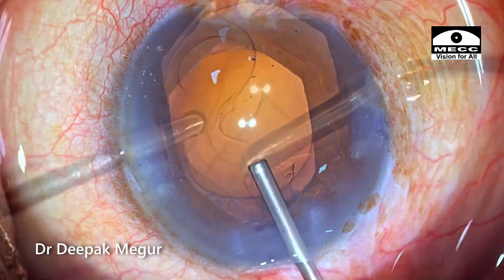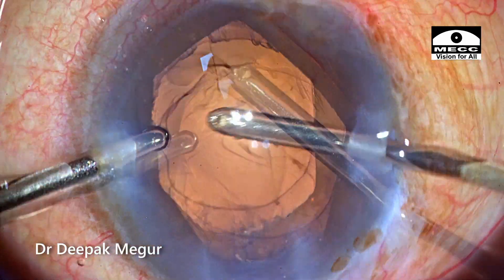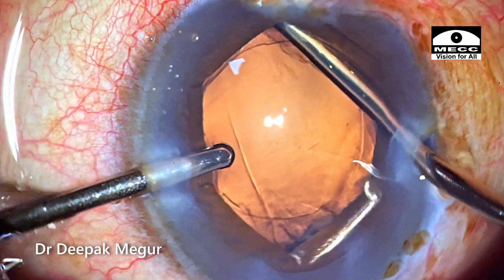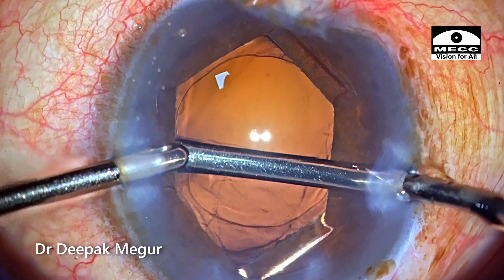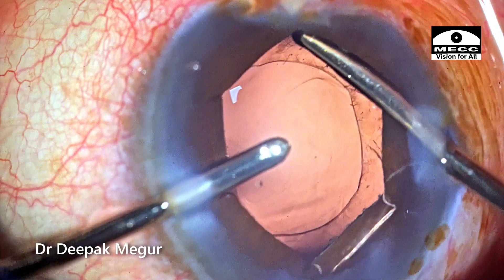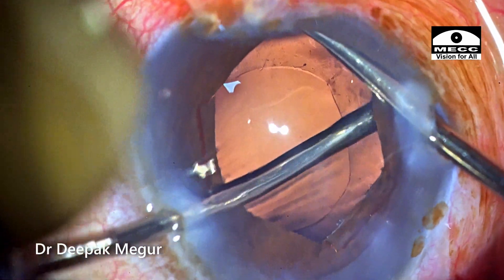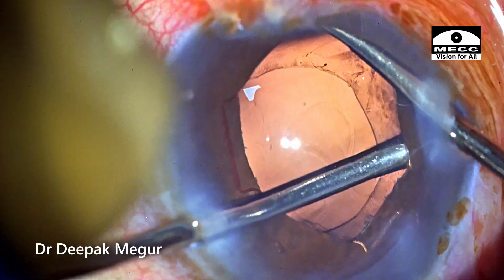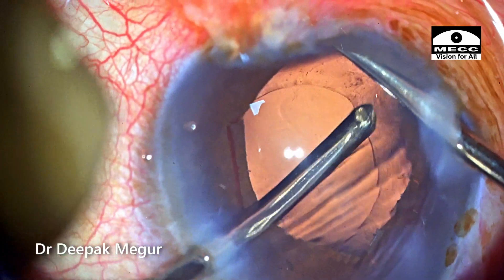Time to aspirate the cortex. I need to be a little bit careful because the cortex would be quite sticky in such eyes with weak zonules, and there's every chance of causing zonular dehiscence during cortex aspiration. I'm retracting the pupil with my irrigation handpiece just to have good visualization. I'm trying to use the tangential method of stripping the cortex, as this is one way of minimizing catching of the anterior capsule, which can increase zonular dehiscence.